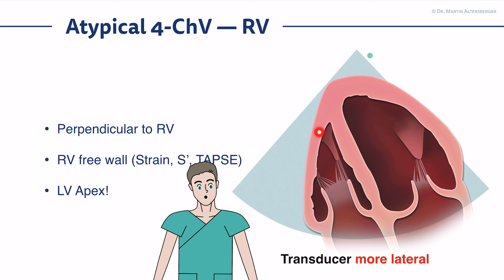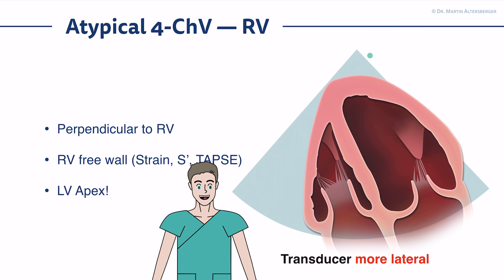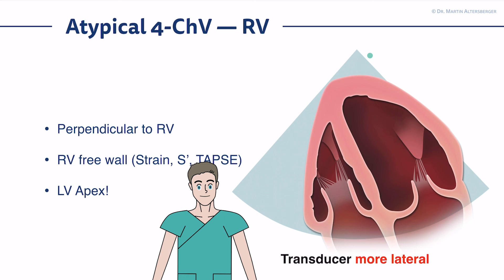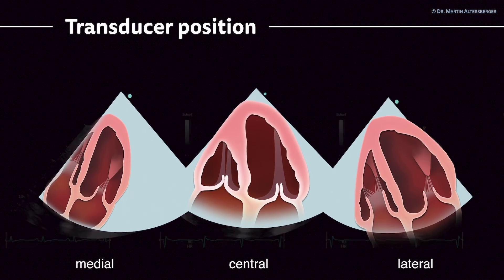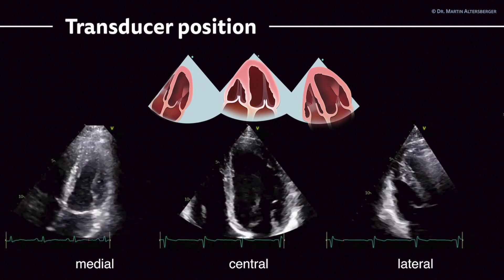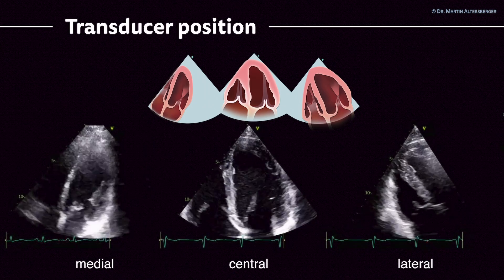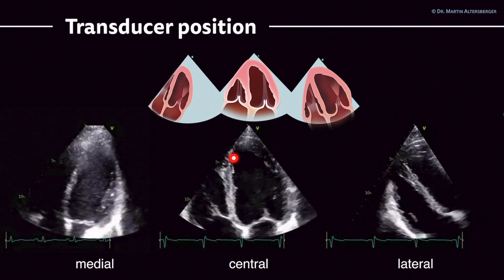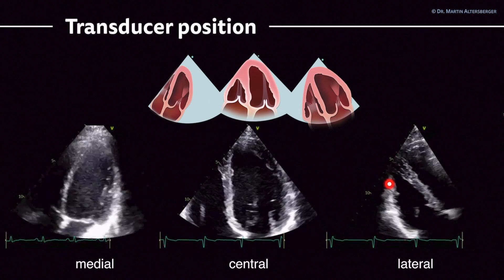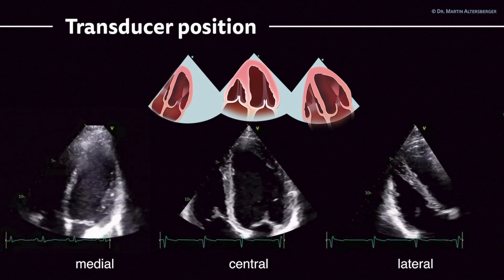Here you see the right ventricle and the left ventricle apex. You should focus on those regions to truly delineate and depict the RV free wall to measure the strain, the S-prime, and of course the TAPSE. Here are examples showing various transducer positions: the more medial view where you see the anterolateral wall, the traditional four-chamber view, and the focused view of the right ventricle where you see the free wall of the RV.